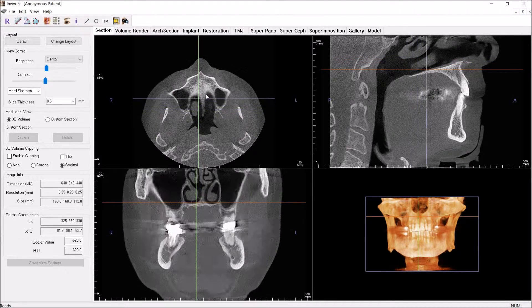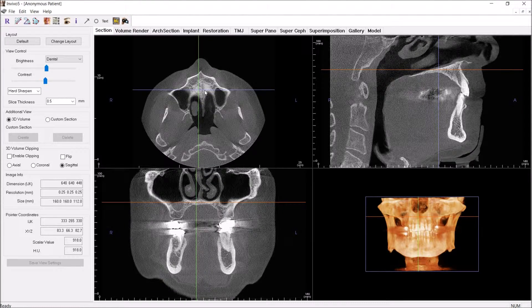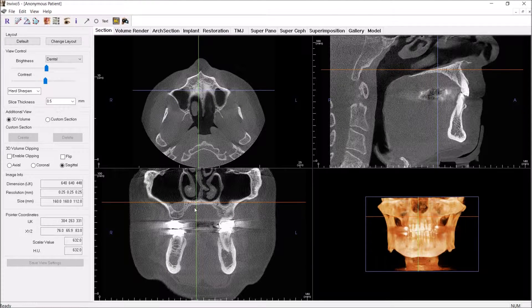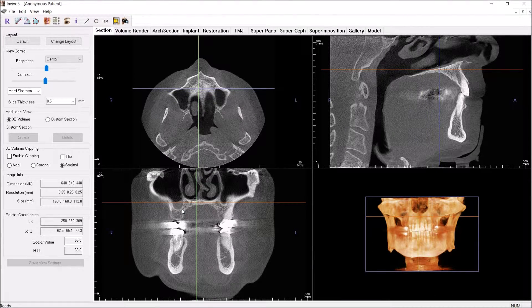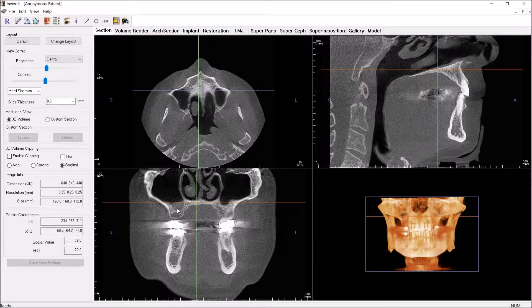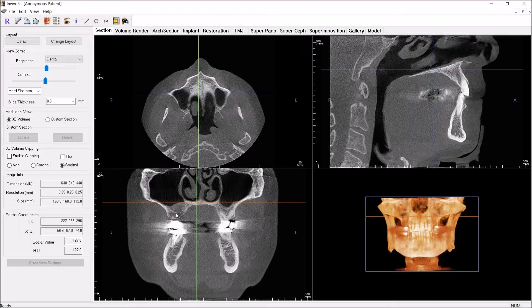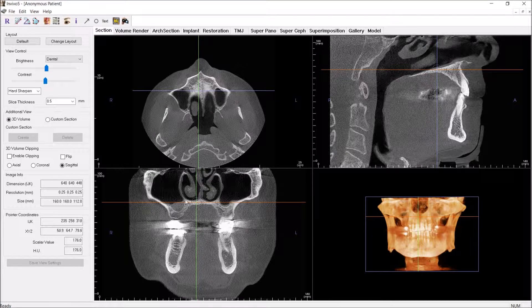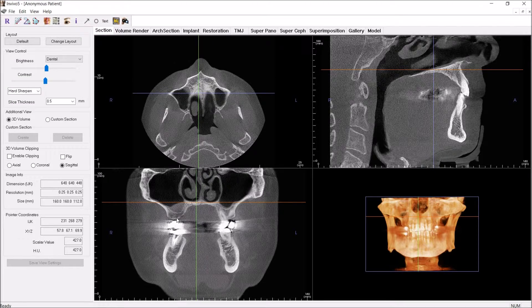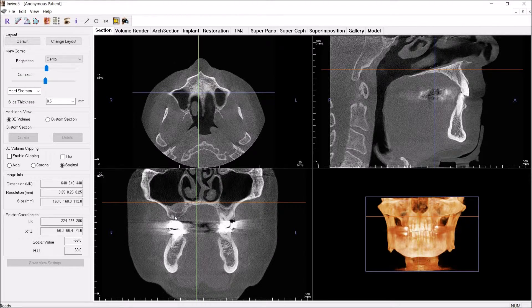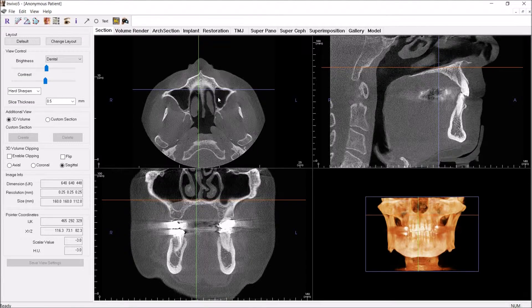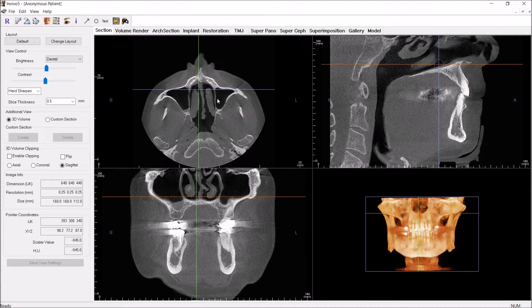If you want to look at another plane you can do that — just drag or use the scroll wheel. There's a little bit of hyperdensity in the alveolar bone, which just looks like probably residual roots of a tooth that was extracted there. Keep going up.